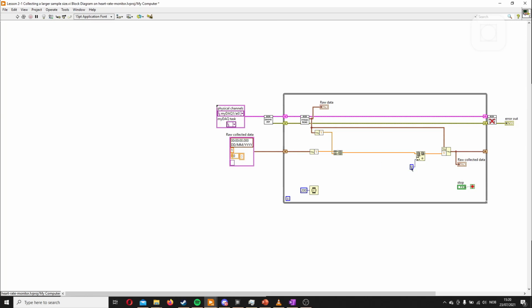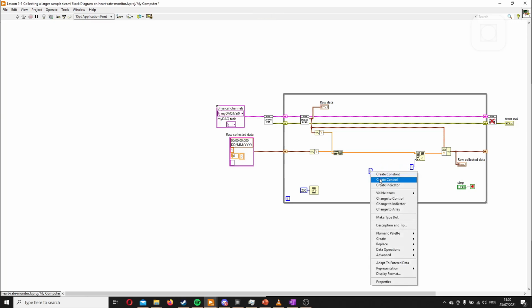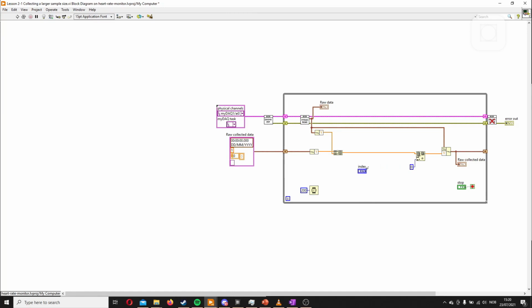And what we also need to do, let's create a control, and then call that samples S. We can do this, which just means the unit is in seconds.